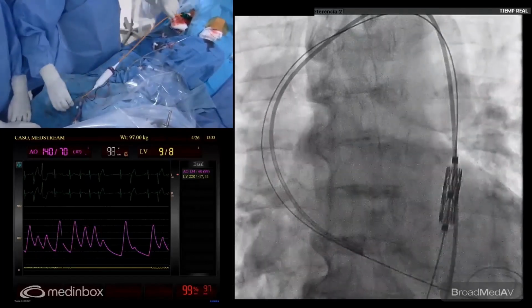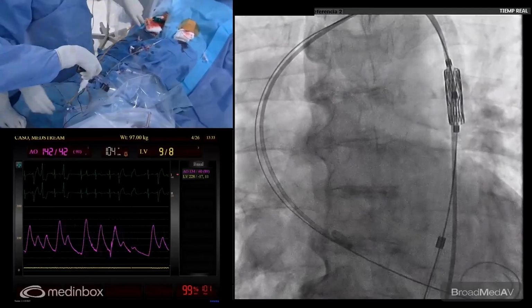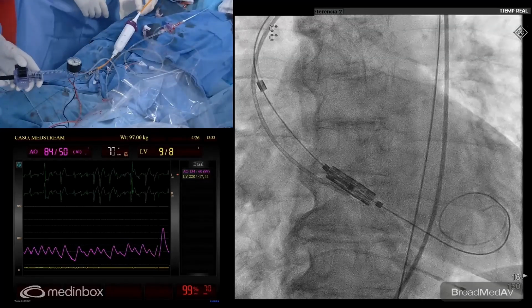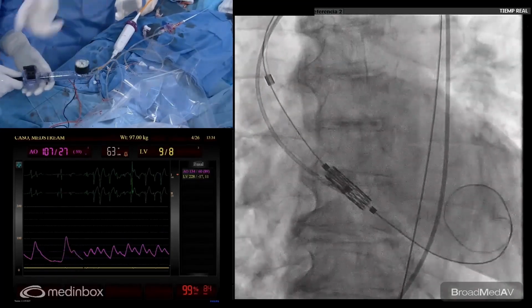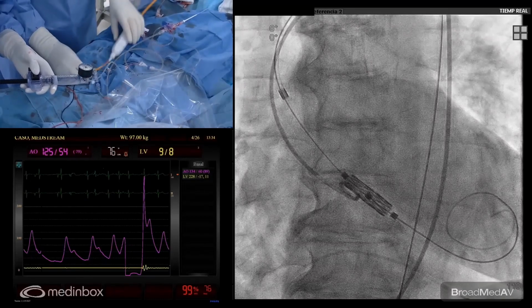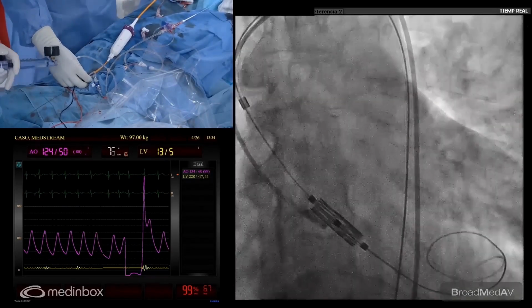So at this point, we deflect 50%. Now we are deflecting. Almost in. Great, great. Let's zoom. So now we will pay attention to the position. Go to the working projection, oblique to the right. We'll always go to the working projection, which here is the cusp overlap.